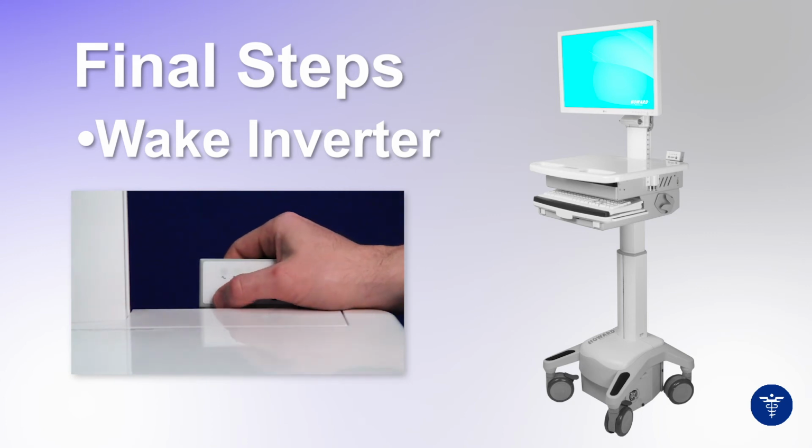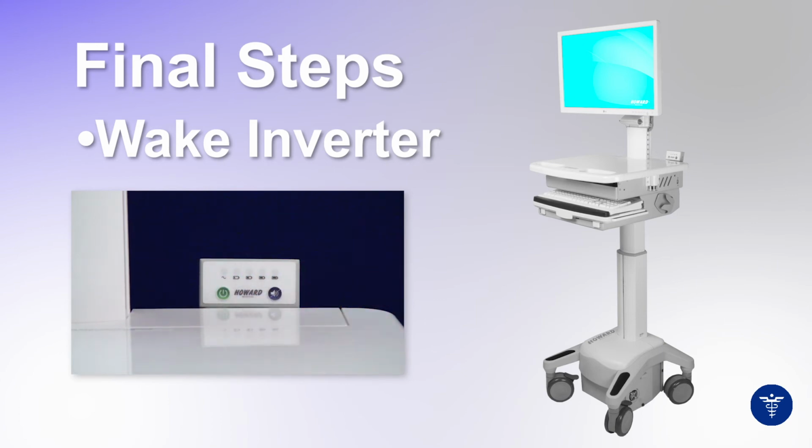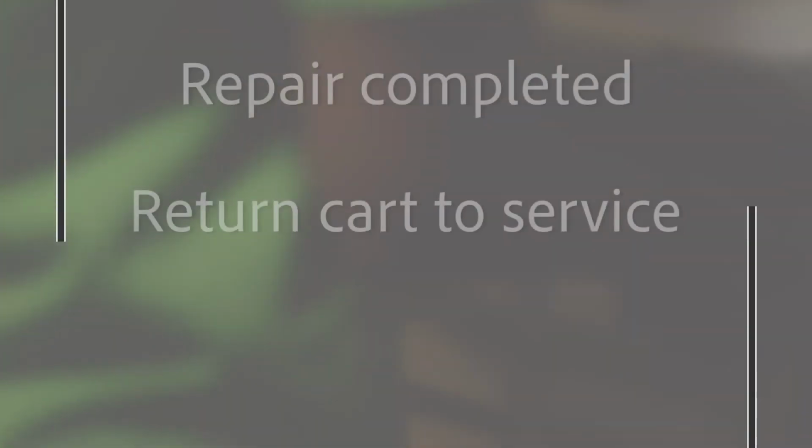Once the fuel gauge shows green, press and hold the on button on the status indicator until you hear a beep from the cart indicating AC power is on. Once this is finished, the repair process is completed. When the cart is fully tested, it is ready to return to service.